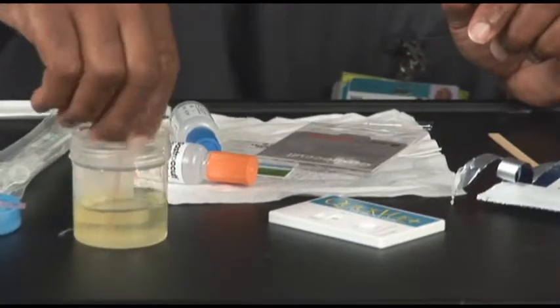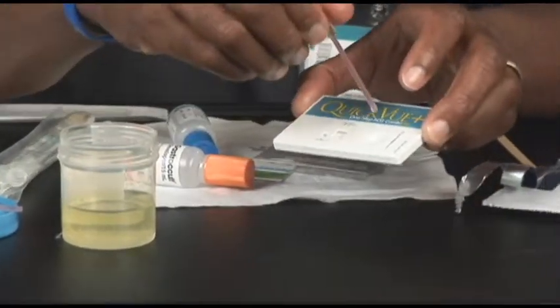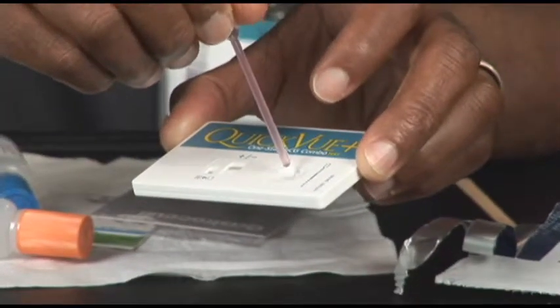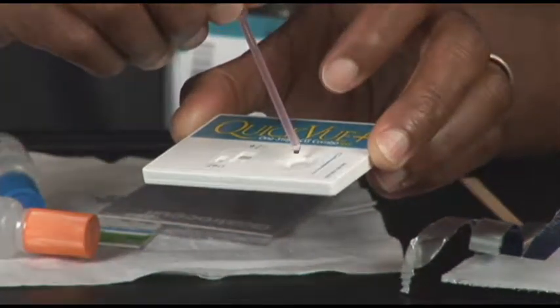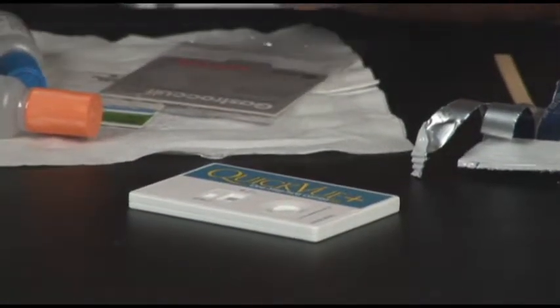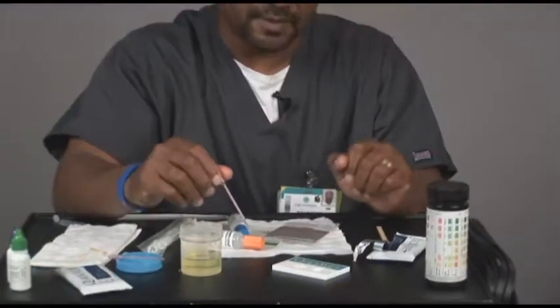Again, you fill your dropper the best you can with urine, and you're going to use 4 drops in the round window. 1, 2, 3, 4. This test has to be read within 3 minutes, not 5, not 6, but 3 minutes.